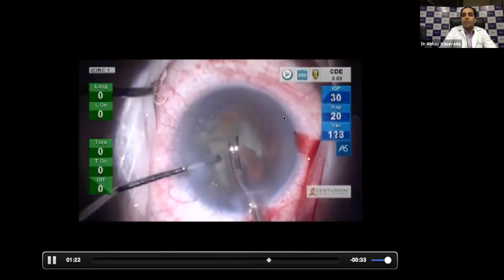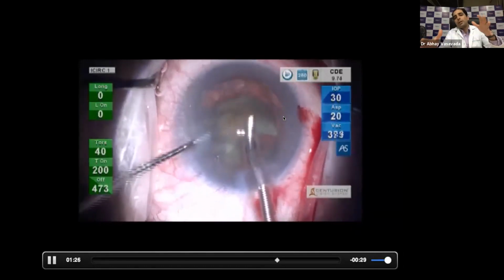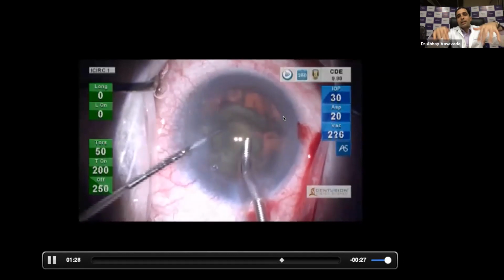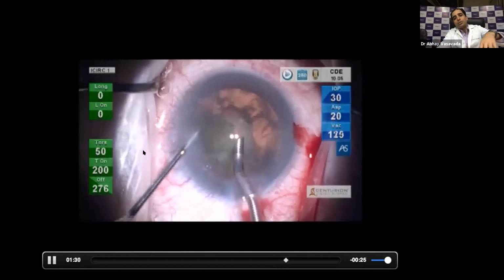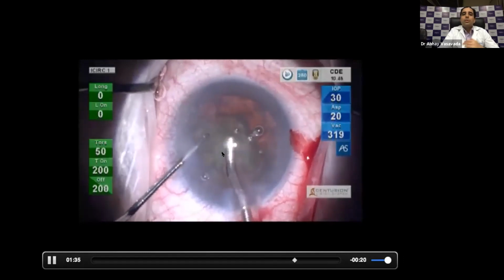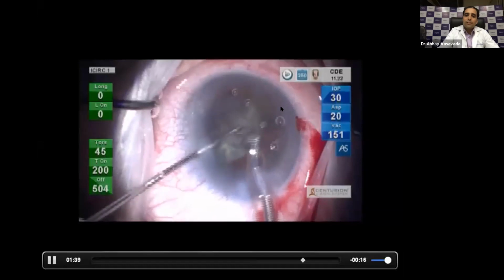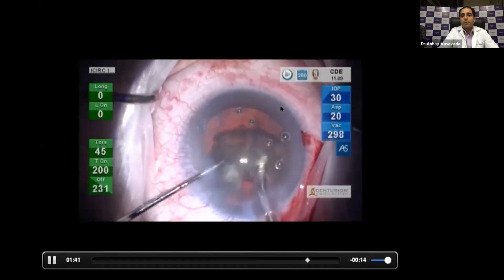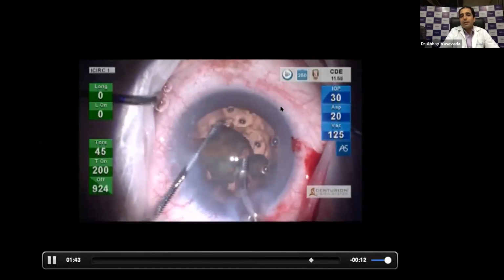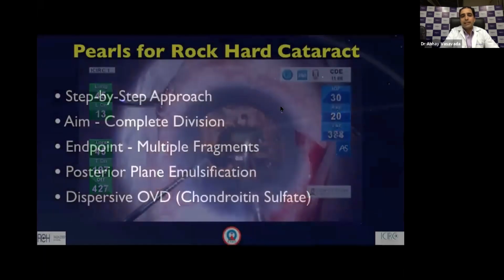and therefore you will be much more comfortable operating rather than operating too deep, where often your hands are unable to reach. Your chopper keeps depressing and leads to folds on the cornea. So low bottle height or low intraocular pressure, along with appropriate vacuum and appropriate flow rate, is something to keep in mind, particularly in cases with high myopia and dense cataract.